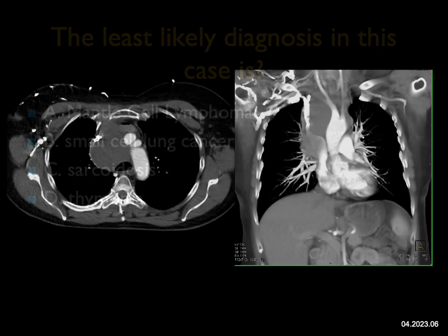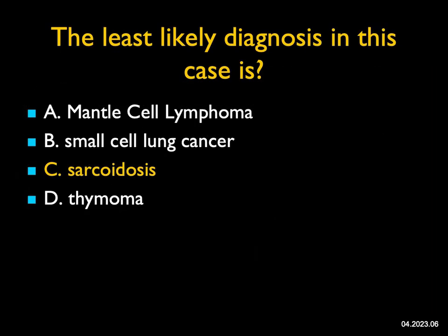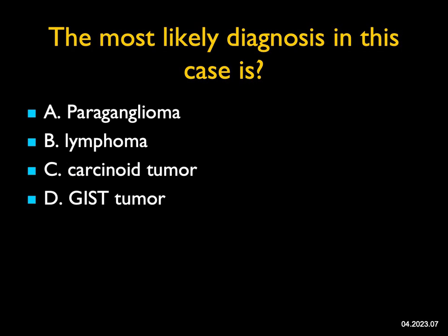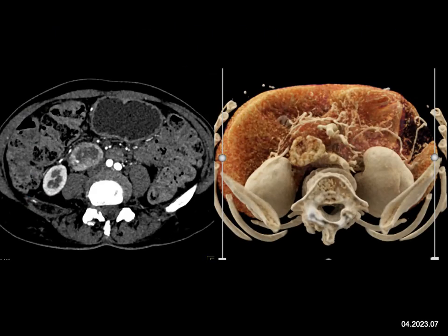The least likely diagnosis in this case — there's a large paratracheal mass infiltrating the anterior mediastinum and narrowing the SVC, well seen on the coronal view. This could be small cell lung cancer, lymphoma — in fact this was mantle cell lymphoma. Thymoma is also a possibility. Sarcoidosis gives nodes but not this large conglomerate mass, and while it can compress the SVC it wouldn't invade it — so the least likely diagnosis is sarcoidosis.